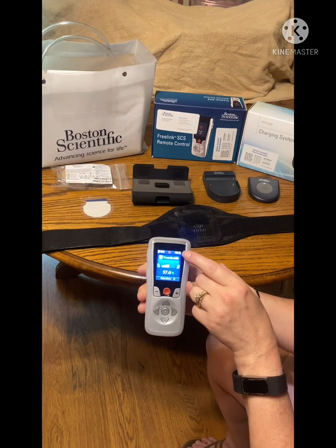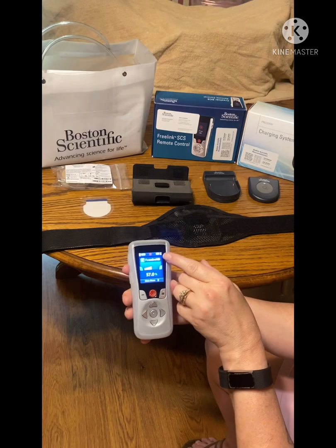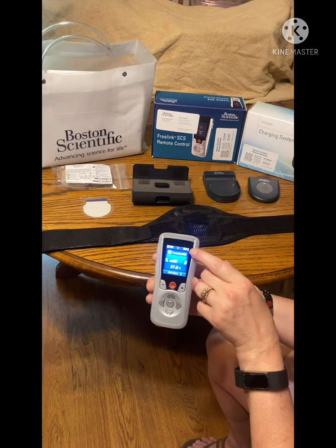In regards to your battery, right here is my indicator for my generator that's implanted. Right now it has supposed to have four bars but it looks like three. When it drops one bar, that's when you generally want to charge it.